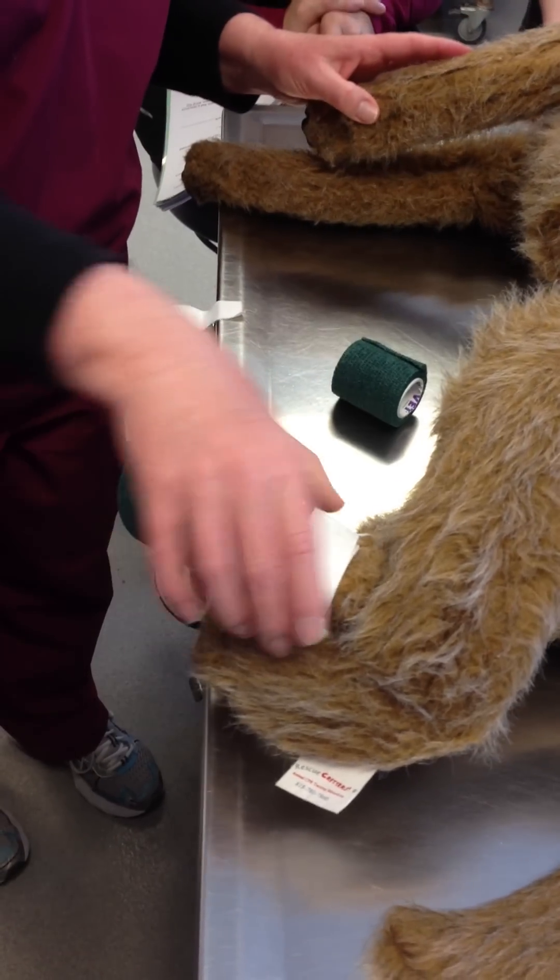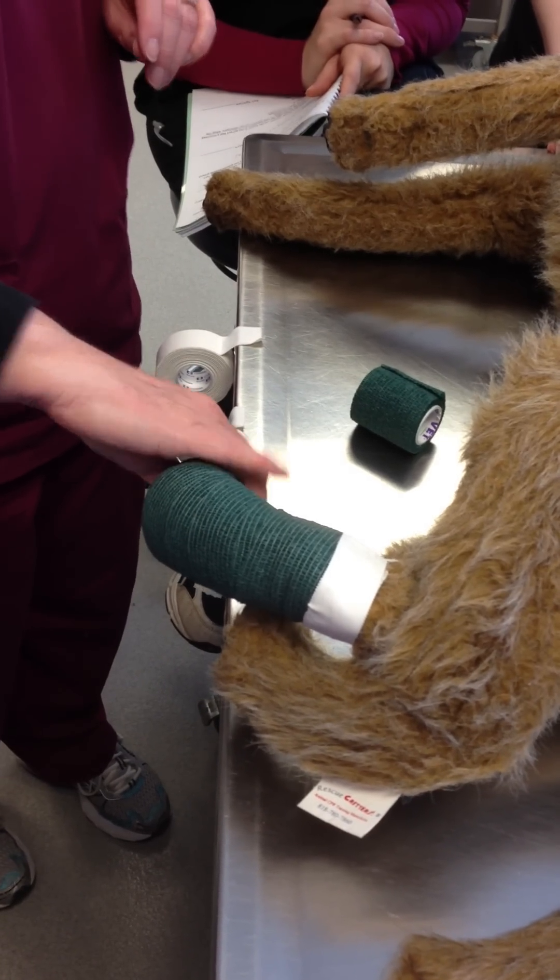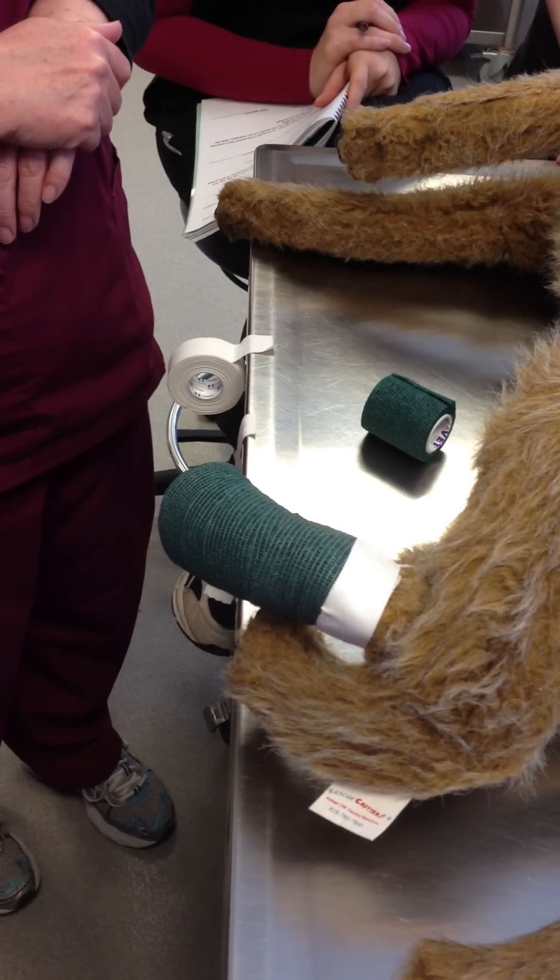That's a nice, comfortable bandage — I think it looks quite respectable. Following the conventions. I want you to try the other one where you don't include the toes when you practice.